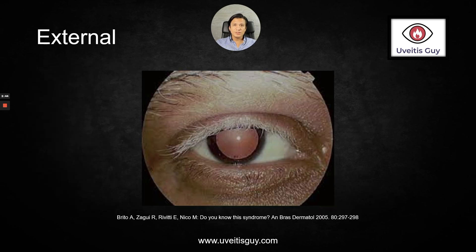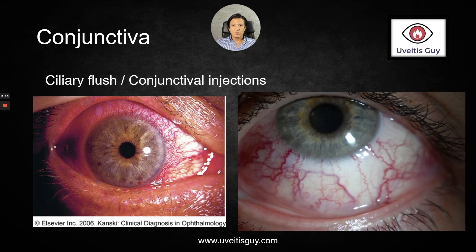The external examination: I take a look at the eyelashes, the skin, the eyelids, and ask them to look up, down, left, and right — like in this patient with VKH. Conjunctiva: I take a look if there is any injection, any hemorrhages, any ciliary flush.